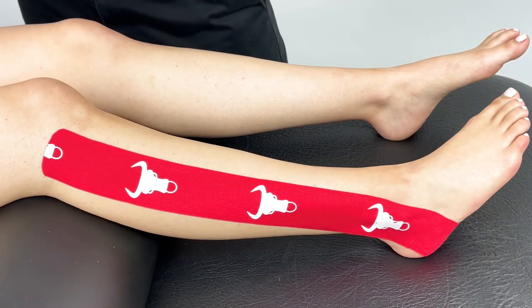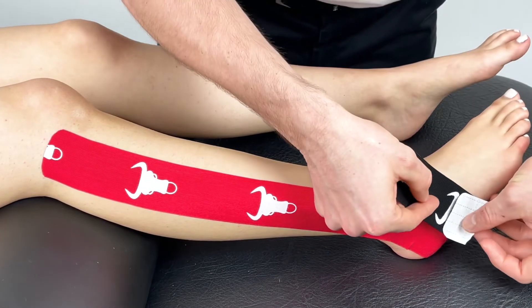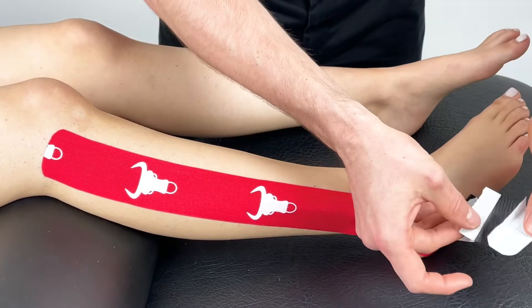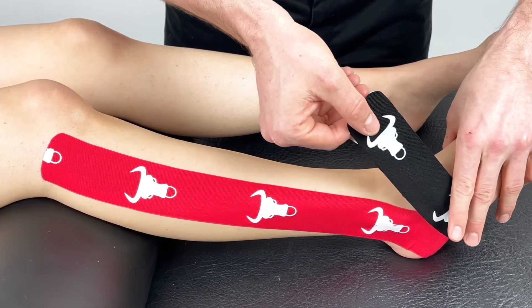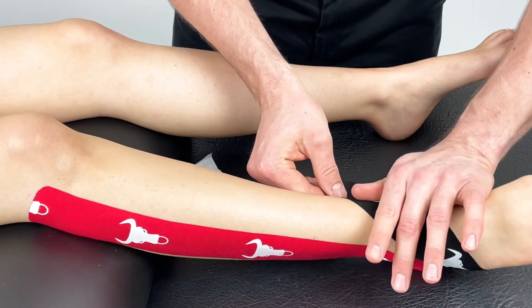From there, your second smaller piece will be anchored just next to the first. Remove the backing tape and apply with moderate stretch diagonally across the ankle, finishing over the medial malleolus.